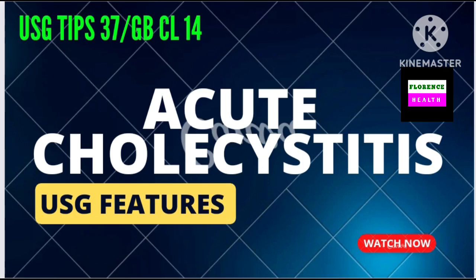Friends, today we will discuss ultrasound features of acute cholecystitis. That means how you will recognize acute cholecystitis on ultrasound.